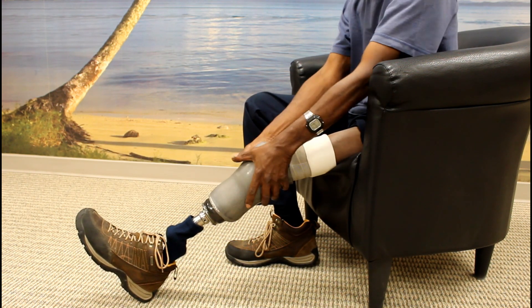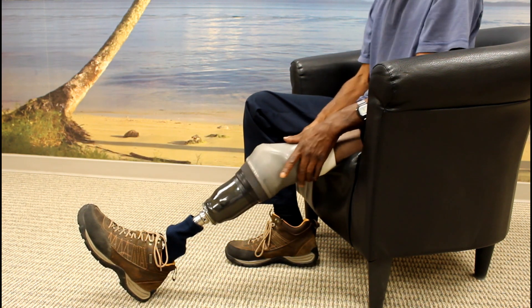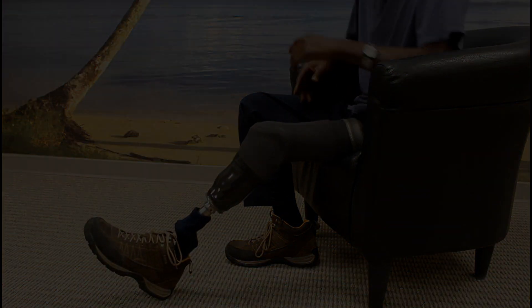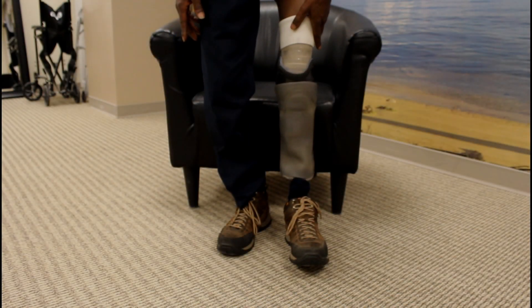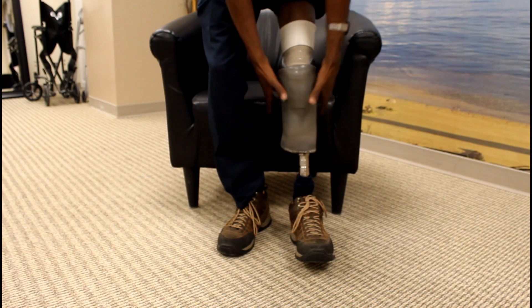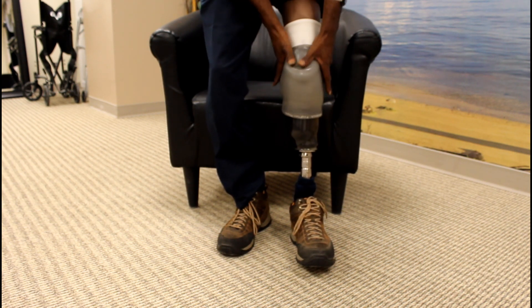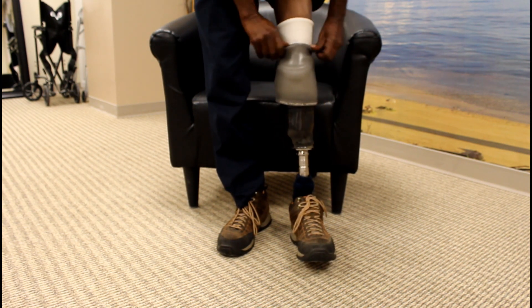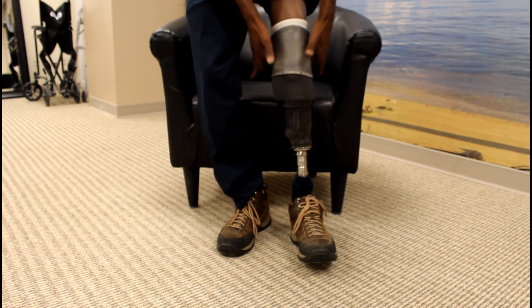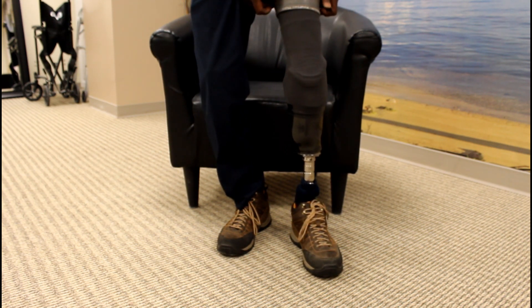Once you have properly donned your liner, you can push your limb into your socket and roll up the suspension sleeve. Some amputees may find that standing to roll up the suspension sleeve can be helpful. While not necessary, standing can prevent wrinkles from occurring in the suspension sleeve which may be uncomfortable or prevent knee flexion.